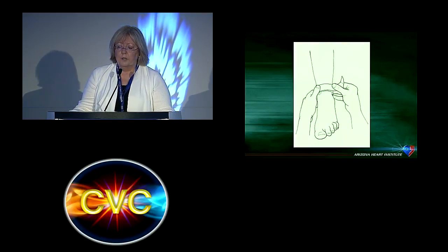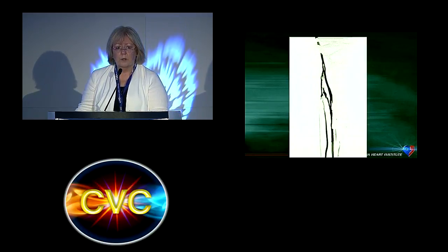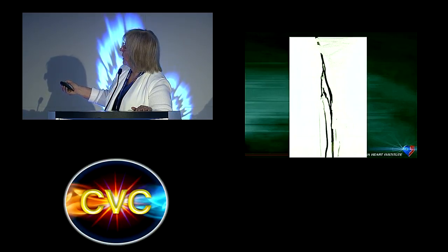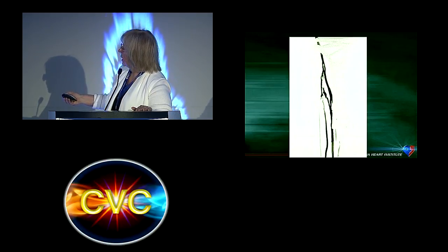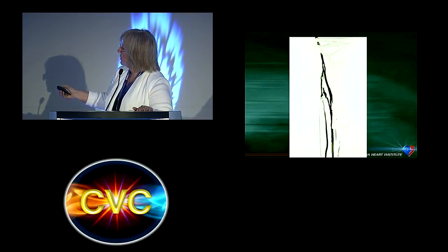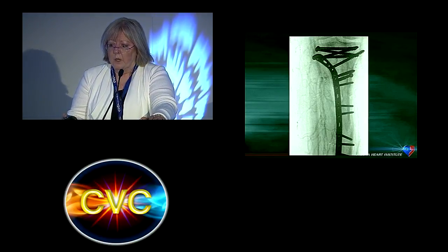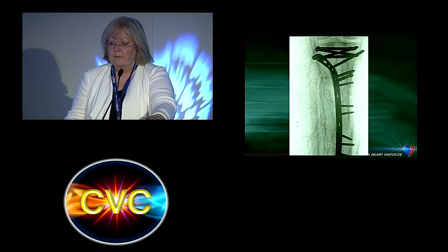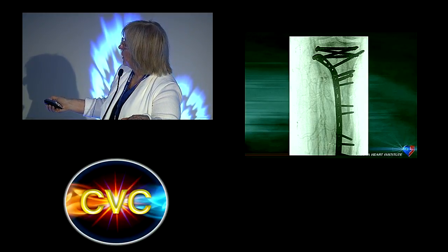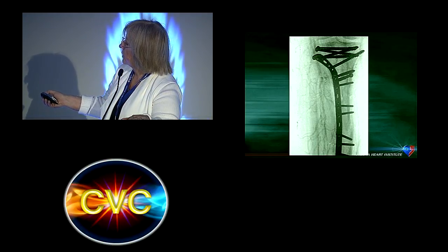So you put a tourniquet on at the ankle, and then you are able to push flow into the deep venous system. Peroneal veins coming up here into the popliteal. I'm not seeing very much posterior tibial, not much anterior tibial that should be coming in here. Those must remain thrombosed. But this is the levo phase, or the late phase, and I want you to notice how many other veins are showing up, what I call the no-name veins, and they're just miles of interconnections here.